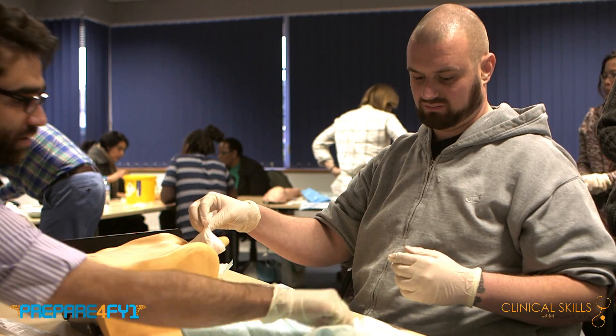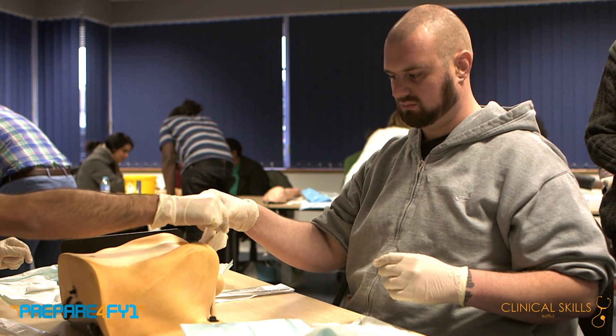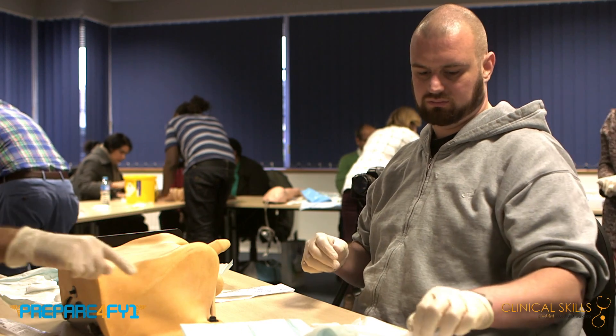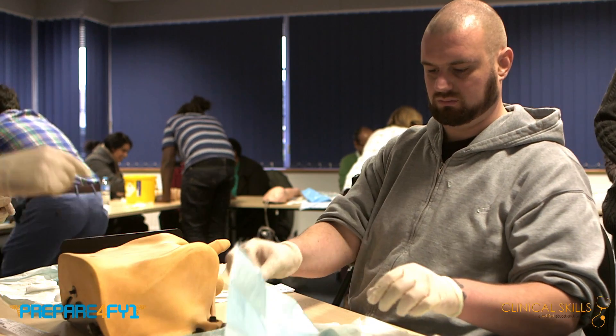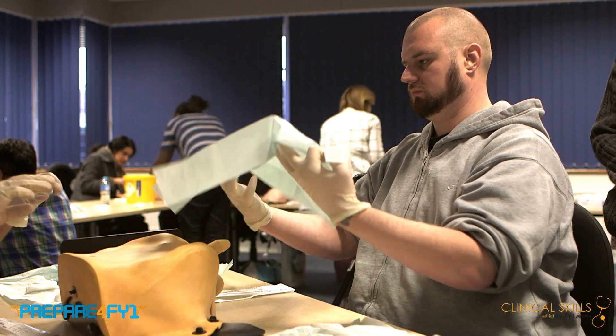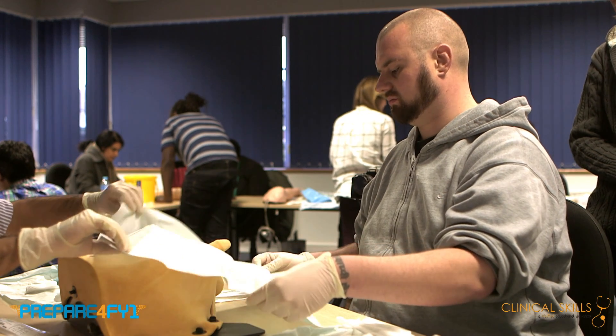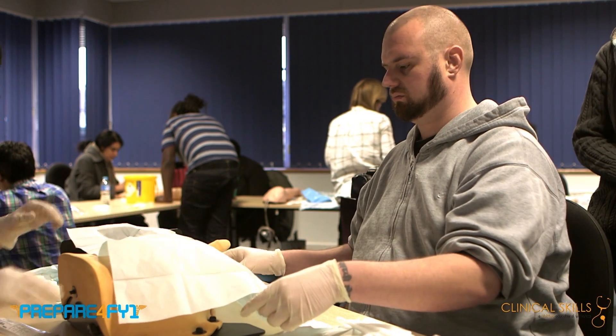Get rid of the dirty swab so it's nicely clean. Then get the drape and put the shiny side down first to make sure that if it does get wet, it's waterproof and doesn't make the patient uncomfortable.